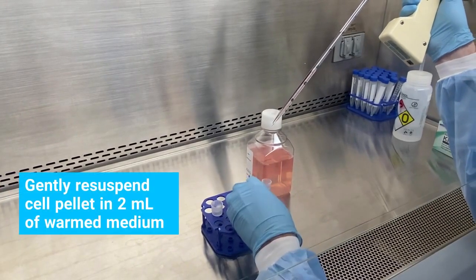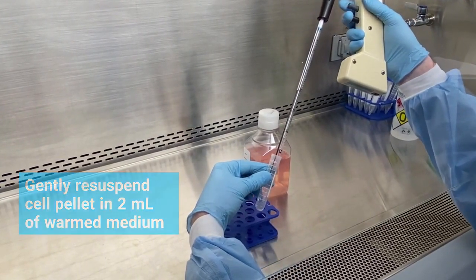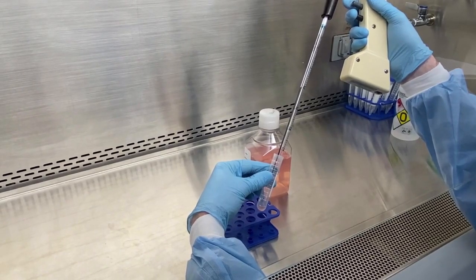Gently re-suspend cell pellet in 2 milliliters of warmed medium. Mix the cell solution carefully to make sure there are no clumps. You may now count the cells and determine viability.